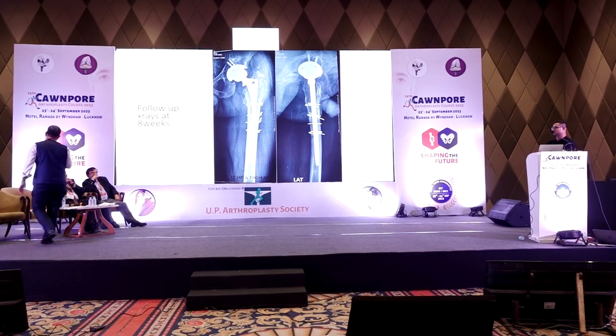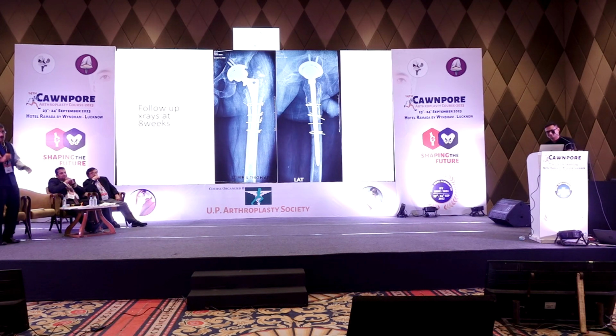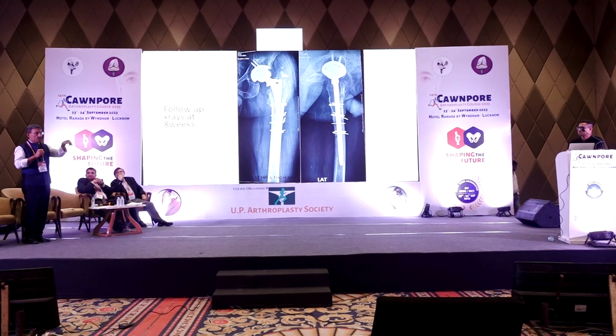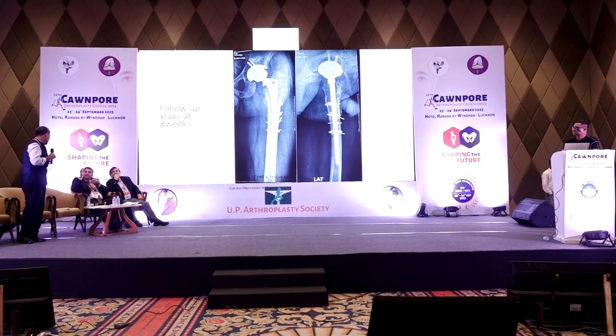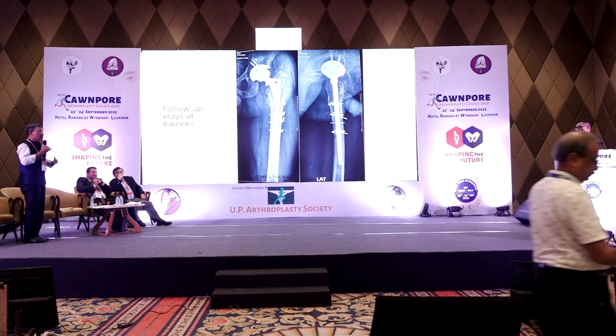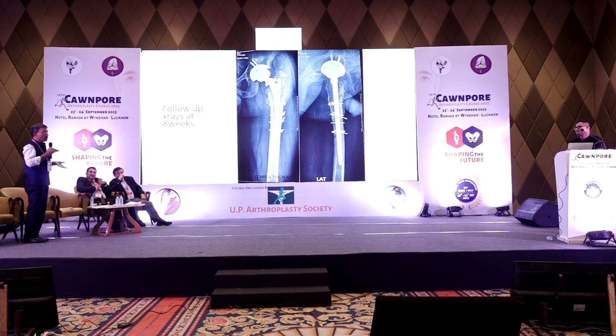Yeah, that's a good idea. So that's why we said that would have been a conservative sort of revision. Just take out the liner, add screws all around, and you would have, pardon? Offset liner. Yeah, and then you can get an offset liner. So just pick up these points so that you don't have to go in for a detailed revision. Yes, sir. Anyway, well done otherwise.